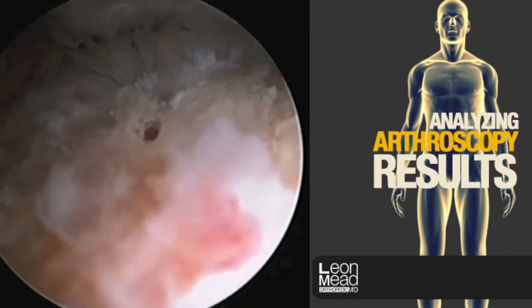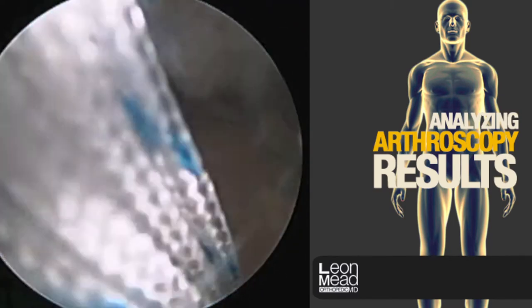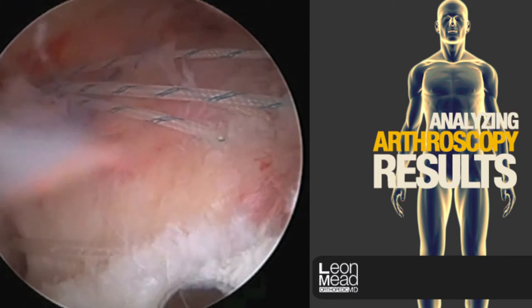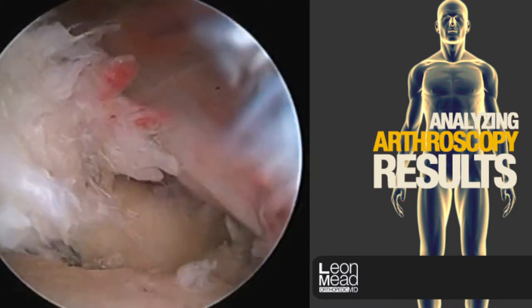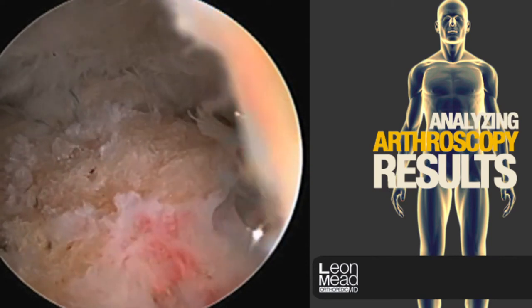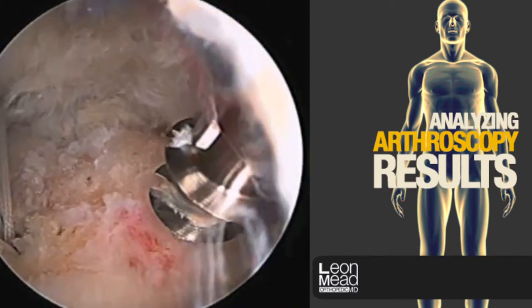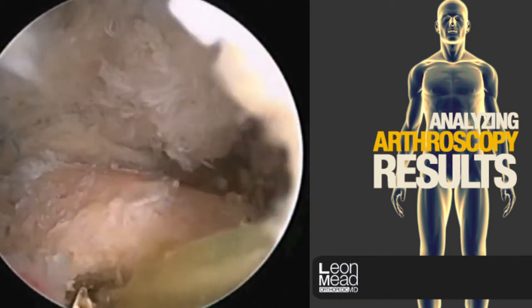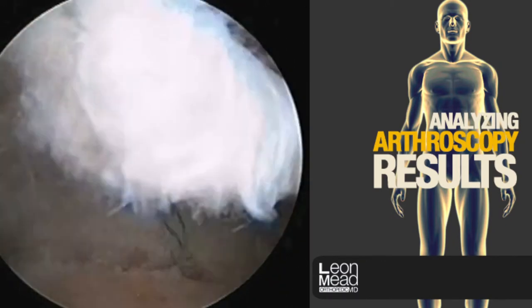Again, another anchor is placed — this is the lateral row anchor, placed on the outer side of the footprint. We see our previously placed sutures. Now those sutures have been passed, and here we have our second lateral row anchor. At this point, it can be a fairly confusing jumble of multiple sutures passing through the cuff.